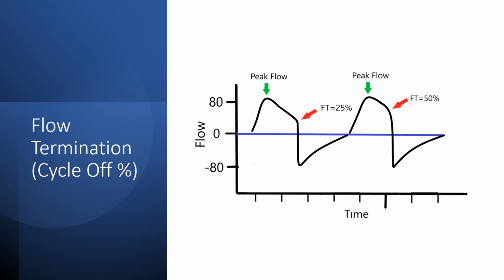And so to give the patient control, you transition from a time cycled breath to a flow cycled or flow terminated breath. Rather than looking at time, it looks at the inspiratory flow rates of the patient to realize when the breath is about to be over so that it can allow the patient to exhale. And this is a parameter that you can set. When you adjust it, it will adjust the overall duration of the breath. So this is another thing that in a bronchospastic tachypneic patient, I can utilize to try to shorten the machine's breathing time to better match the patient.